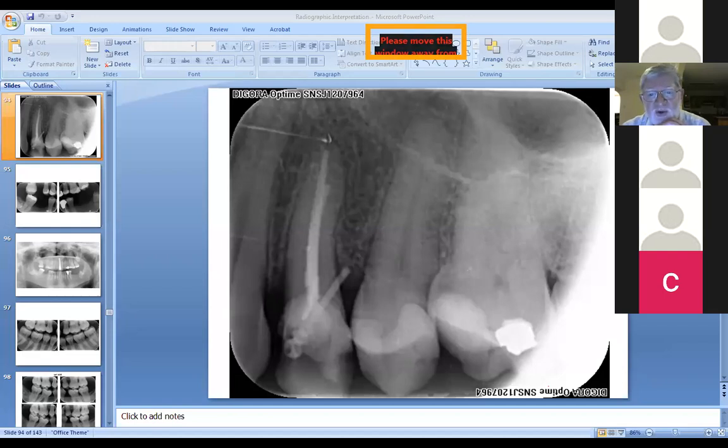I think you shouldn't be as fearful as you are. It depends how carefully you're removing everything, and just checking carefully after too. When you've got a lone standing tooth and the sinus floor has come down, as was the case with a 2.7, 2.5 area where the sinus floor had come down almost down to the ridge, then you've not only got a lone standing tooth if the 7 needed to be removed, but you've got the sinus floor low down. Then your risk is quite high.